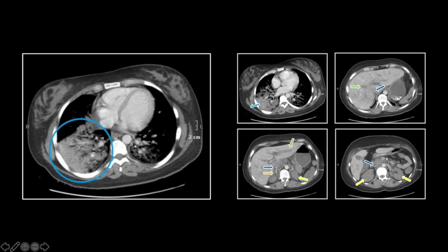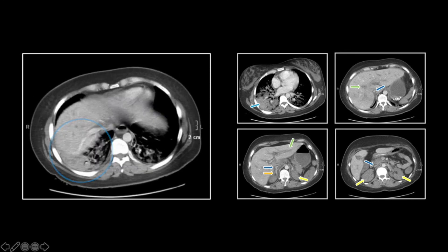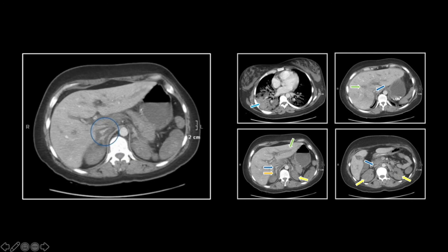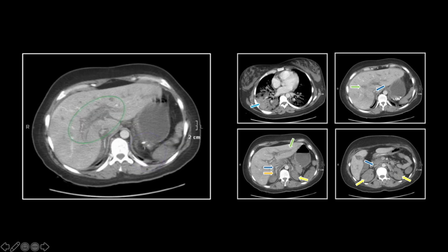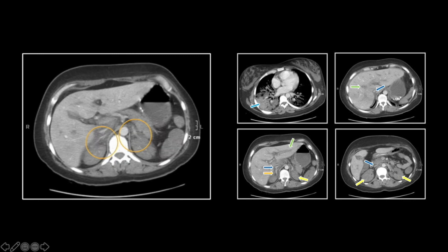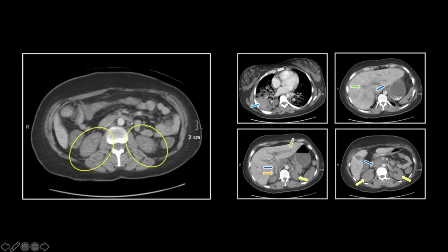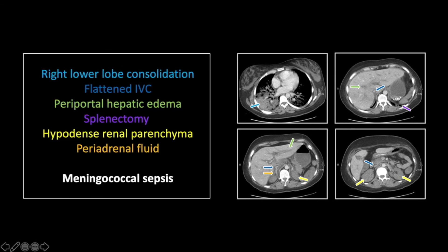On the cine, you can see the right lower lobe consolidation, IVC flattening, periportal edema, the splenectomy, and the hyperdense adrenal glands. Lastly, the markedly hypodense kidneys, again related to hypoperfusion. This was accurately called by our radiologist — the emergency room was shut down, all involved parties were prophylaxed, and the outcome was as good as it can be with an infection of this severity.